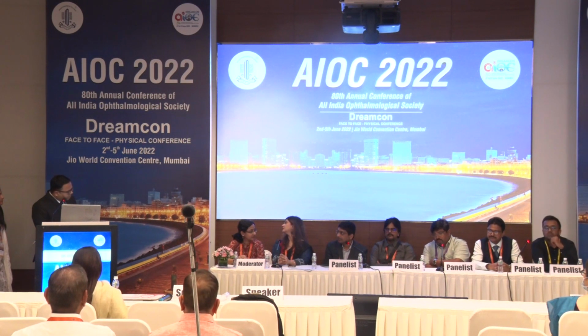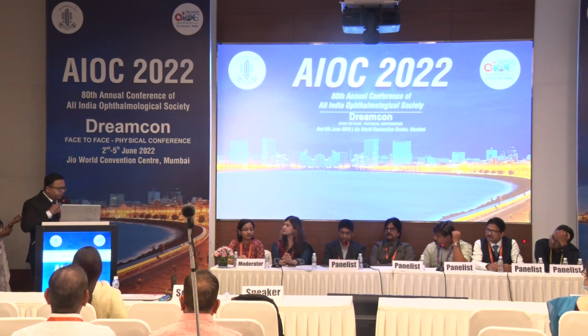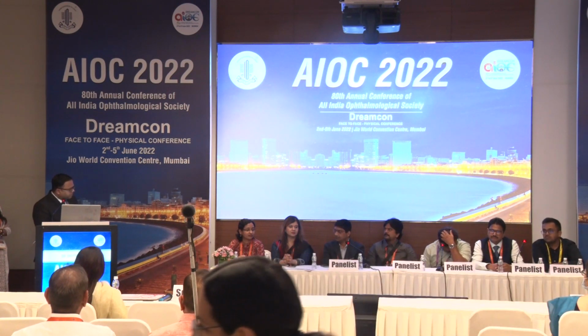What is the importance of timing in such surgeries? I was actually surprised because when the patient presented to us, there was no vitreous hemorrhage, but on the OT table there was breakthrough vitreous hemorrhage. This was an old vitreous hemorrhage. It was not a fresh red-colored hemorrhage. You can see it was a khaki-colored vitreous hemorrhage, which itself suggests it was long-standing. Yeah, that's the thing.